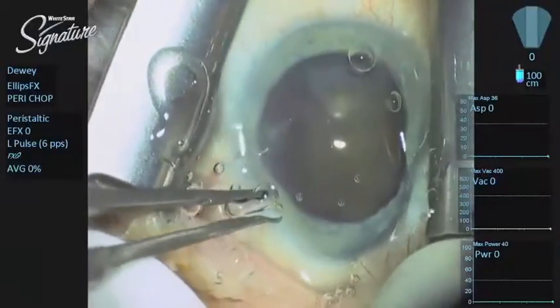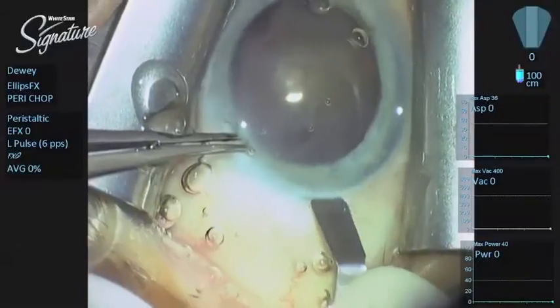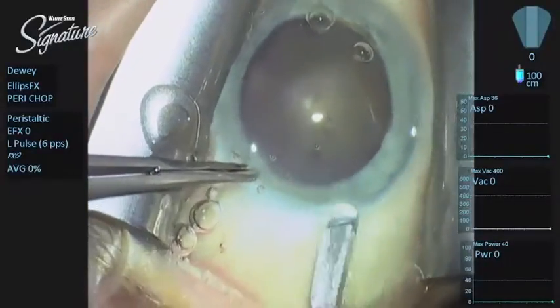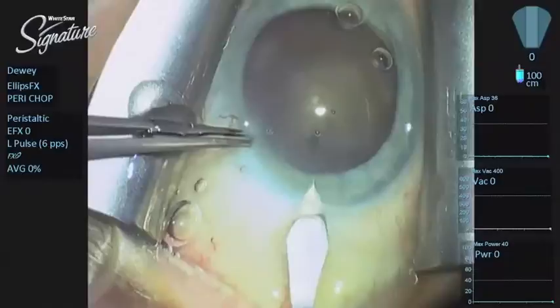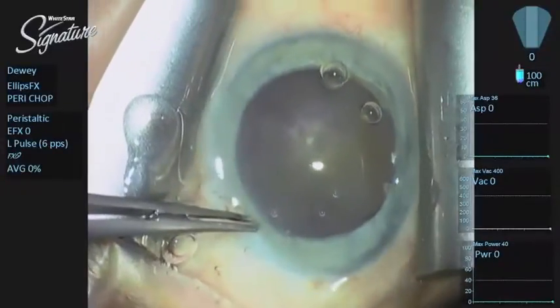The Signature system is delightful because it allows you to work through a 2.2 or 2.4 millimeter incision. Depending upon my mood, I will either make a three-plane incision — I'll start with a limbus-based groove — or I'll just do a single-plane incision with the 2.2 millimeter keratome.